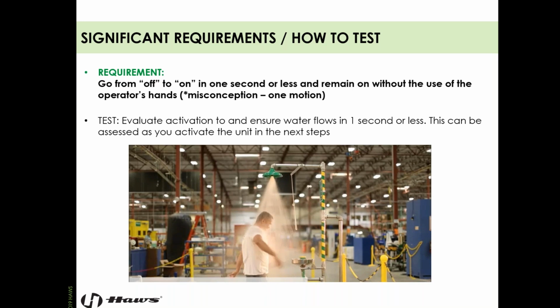Just to stress how important this is, you're going to have other emergencies to deal with. You need to be able to hold your eyes open like you see McDean doing here. You need to be able to remove your clothing. You need to be able to deal with a lot of other things going on. And you don't want to have to worry about keeping the equipment on.